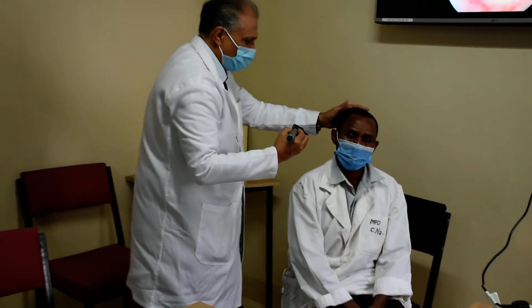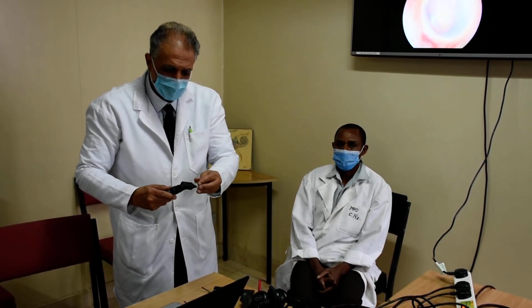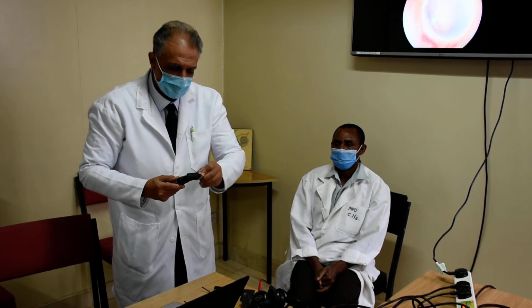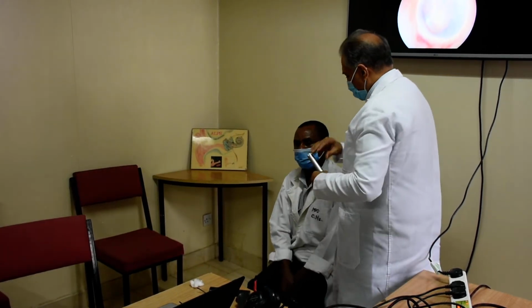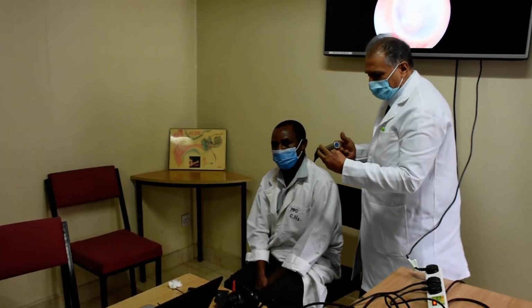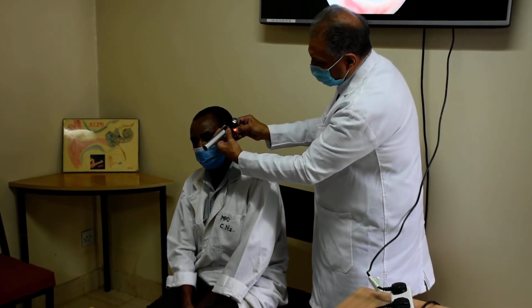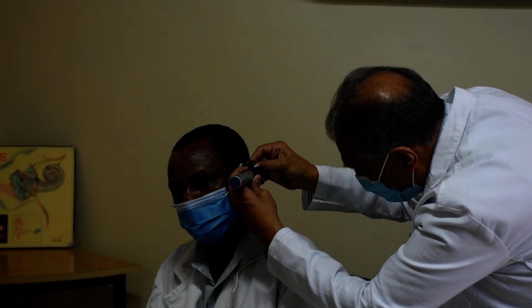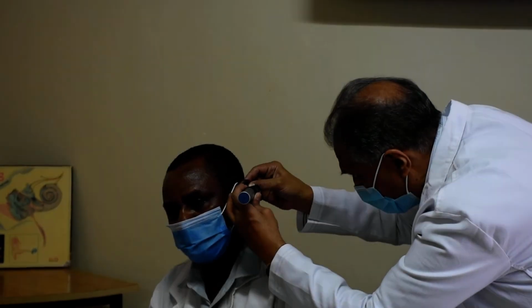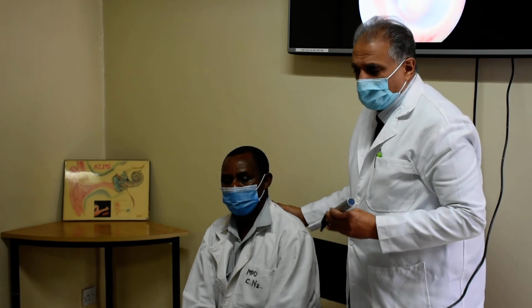Once you have examined that side, you immediately clean your speculum. You never mix the two sides, because you may introduce infection from one side to the other. And if I may demonstrate to you, you then change hands. Left hand for left ear. Again, like a pen, same technique, make a fulcrum, pinna upwards, outwards and backwards, and then you introduce your speculum gently and gaze at the external auditory canal and at the tympanic membrane. You may identify wax, you may identify inflammation, you may identify foreign bodies, and that is the value of otoscopy.